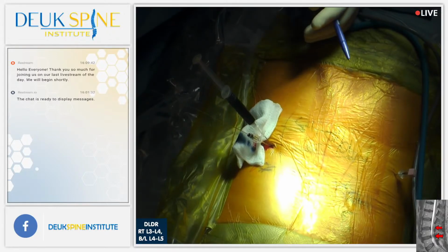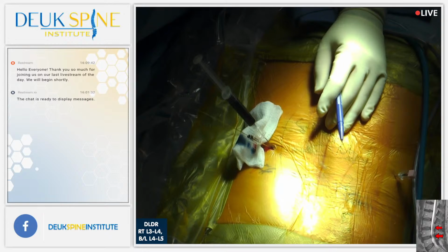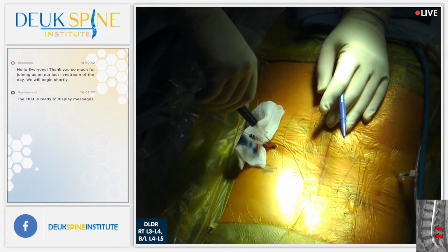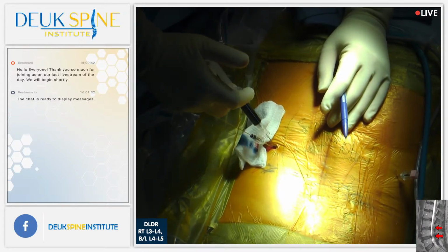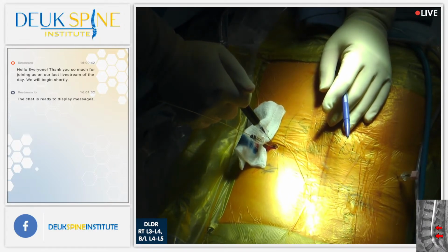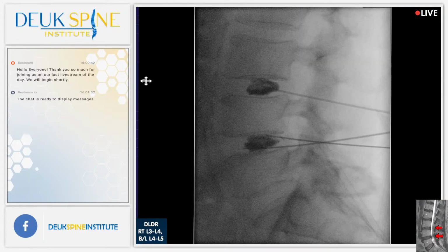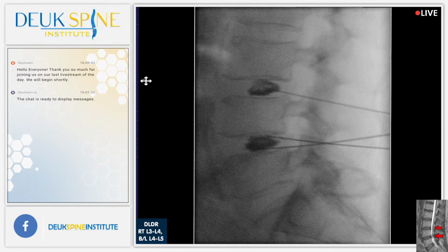All right, is she comfy? Any pain? She's still a little sleepy. How bad is that on a scale of 1 to 10? Give us a number. She said a 10. Is that where you get pain typically? She said yes. All right, 10 over 10. You can put her back to sleep. I wouldn't put her too deep.